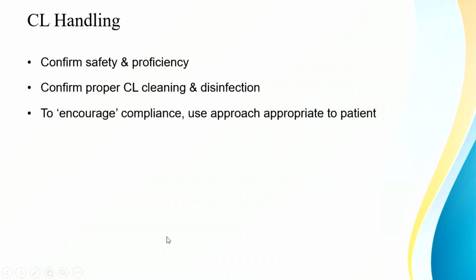So they have to air dry the lens case. They shouldn't fill the solution in it and keep roaming with it. They have to keep the lens case dry and air dry it, which is a better option also. And proper cleaning and disinfection is very important. If the cleaning is not good, again the deposits will come. So all these things should be taken care of.